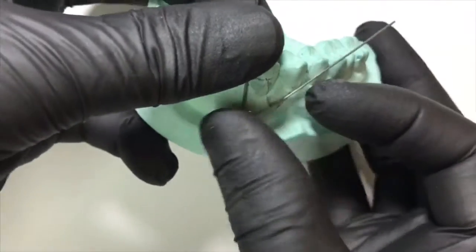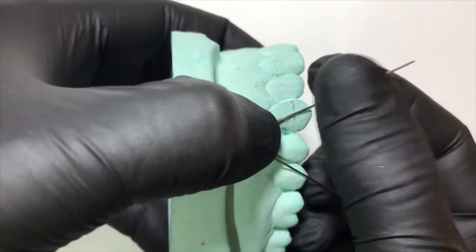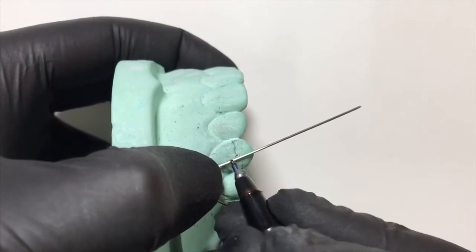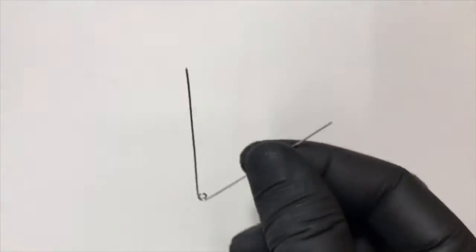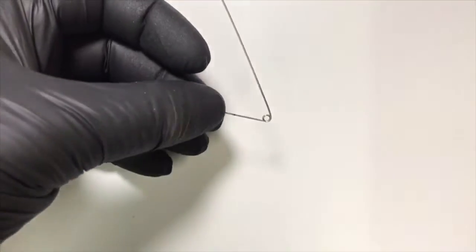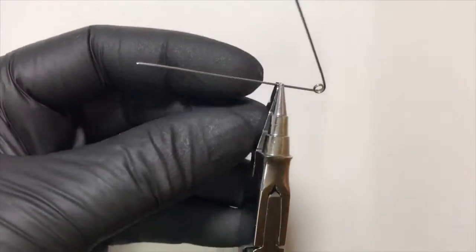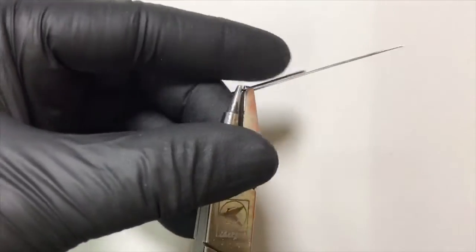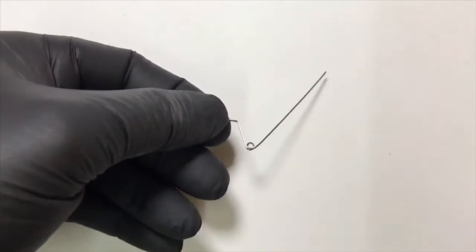In the next step we check its adaptation on the cast and begin with our second marking where the active arm would bend and engage the canine. The marked point is where the active arm engages the buccal aspect of the canine. We give a sharp 90-degree bend using the square beak of the universal plier, keeping the same plane so it is not distorted.